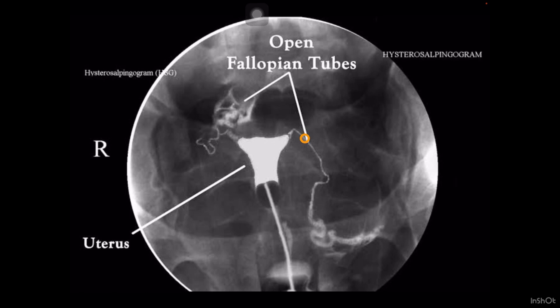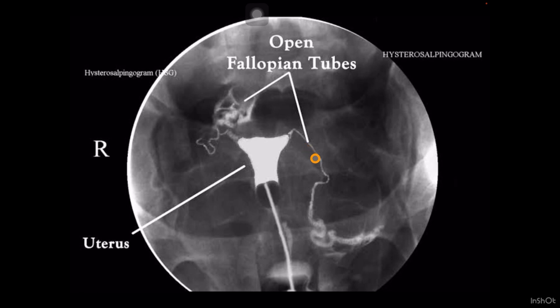To summarize: the isthmus is the narrow straight part very near to the uterus; the ampulla is the dilated serpigenous part; and the last part is the fimbrial part, also called the infundibulum. Whenever we see salpingitis isthmica nodosa, we always focus on the isthmus part. This condition occurs due to chronic inflammation of the fallopian tube, causing hypertrophy of the smooth muscles of the isthmus, which results in diverticula-like projections of the mucosa inside the smooth muscle layer. On HSG we will see diverticula-like structures in the isthmus part of the fallopian tube. Hopefully you will understand — if there is any query you can ask. Thank you.